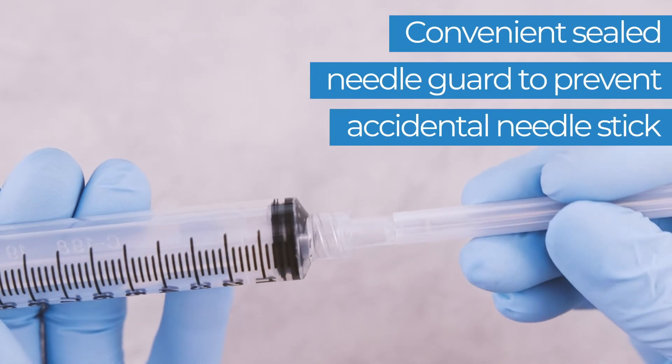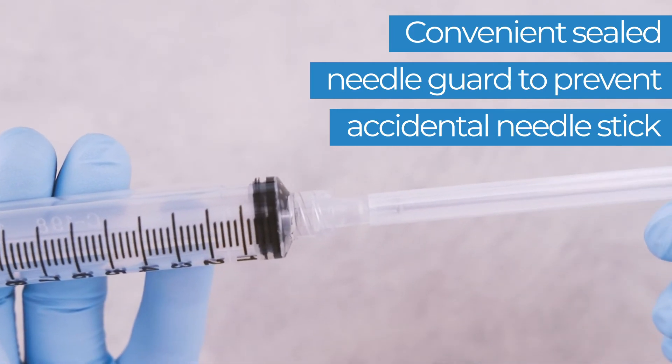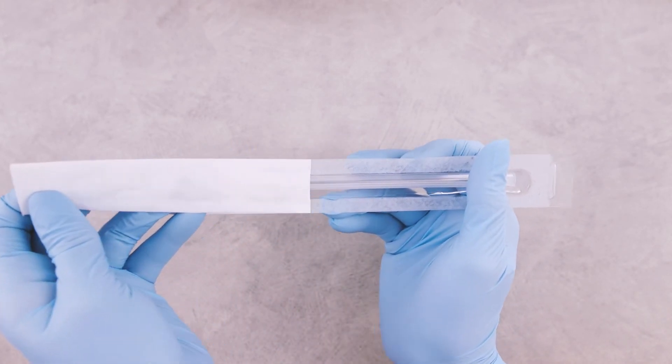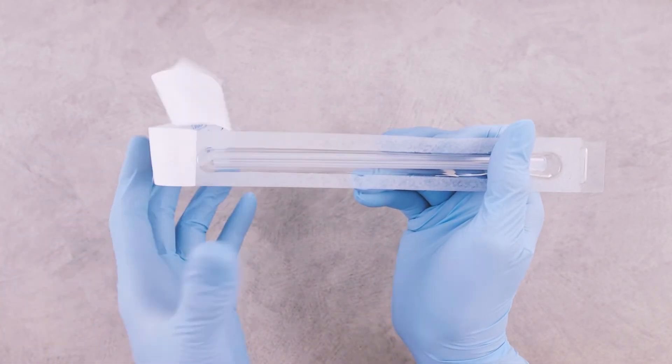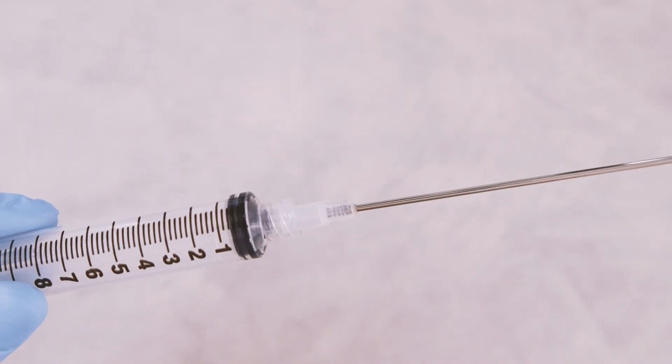Each needle in the R-Extract line comes with a convenient sealed guard to enhance pharmacist and clinician safety. To use, simply remove the needle from its sterile package using aseptic technique. Attach the needle to your syringe, then remove the needle guard using a twisting motion.